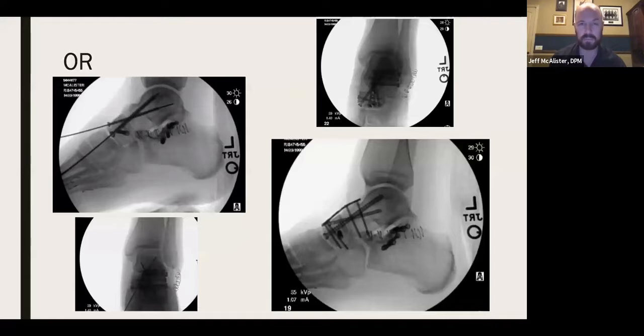So that's been my priority. My number one product of the two is the putty. I'll start with the 2, and then if I need to, I'll slap in another 2. I would say for most cases, I'm using the 2.5. There are 2 different sizes, right? The 2.5 and the 5 for, in Phoenix.